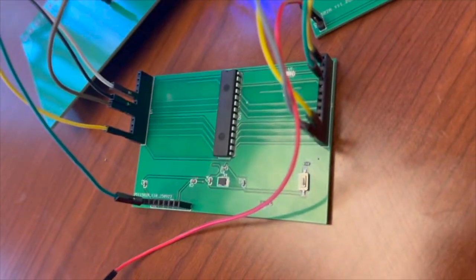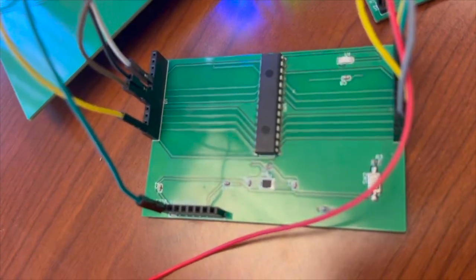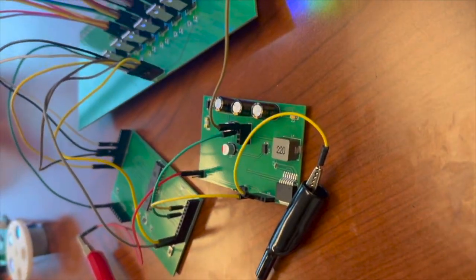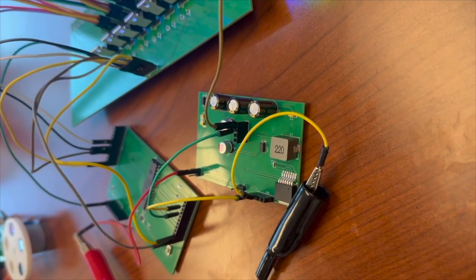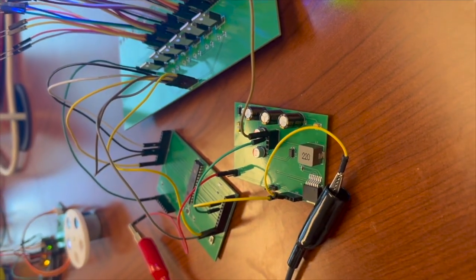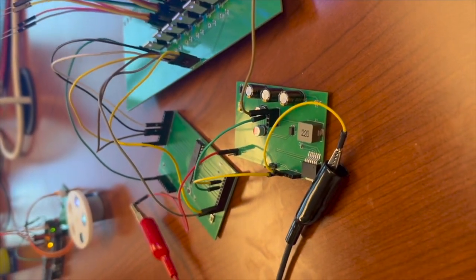The ATmega328 microcontroller board serves as the central control unit. It generates pulse width modulation signals that regulate the LED brightness and, in standard operation, the motor outputs. By adjusting the duty cycles of these signals, the system achieves variable intensity for LEDs and precise motor control for actuators.